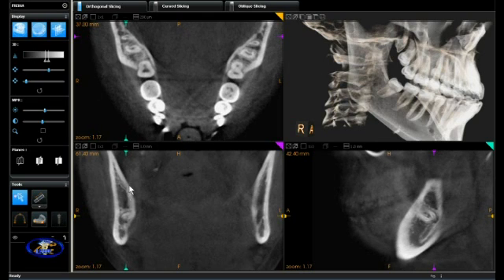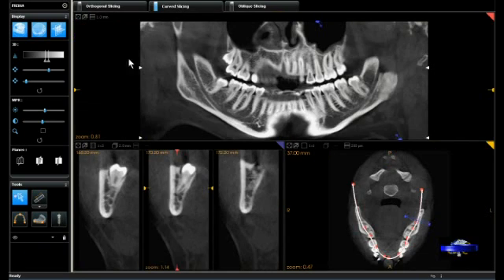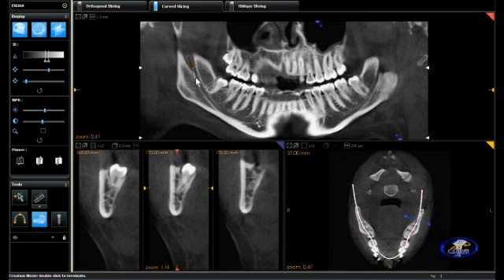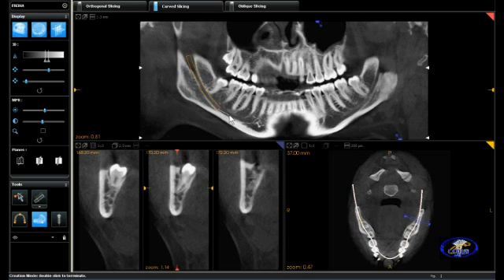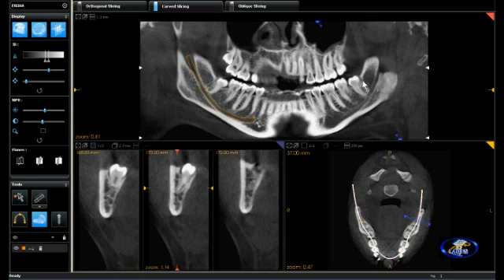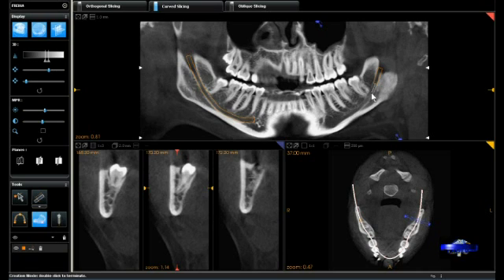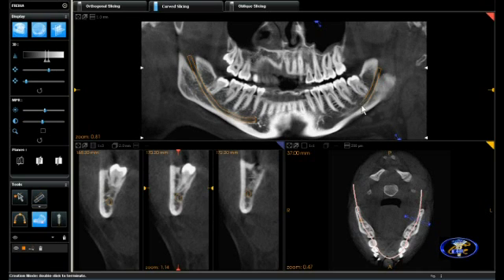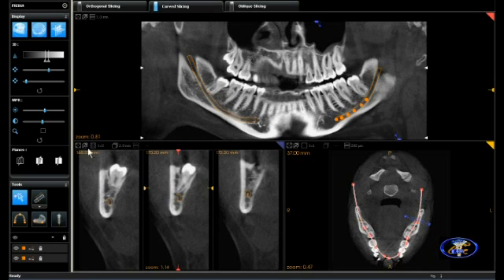Going to curved slicing allows us to construct a panoramic projection. We are now marking the nerve canal on the patient's lower right using a colored animation, and we'll go ahead and make the nerve canal animated on the lower left side as well using a colored animation. Once the nerve canals have been clearly marked, we're better able to understand the relationship when we make a cross-sectional cut.